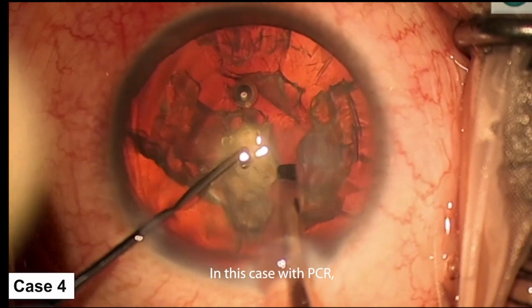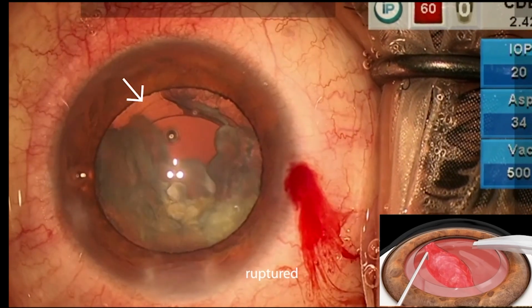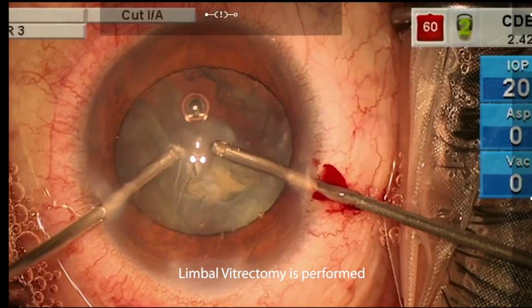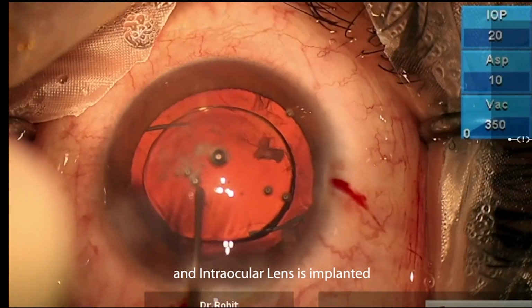In this case with PCR, the posterior capsular tear edges are scalloped and non-fluttering, which indicates ruptured anterior hyaloid face and vitreous prolapse. Limbal vitrectomy is performed and intraocular lens is implanted.